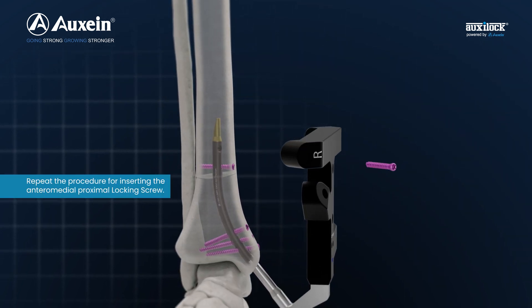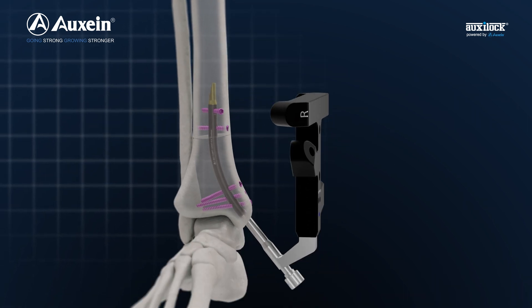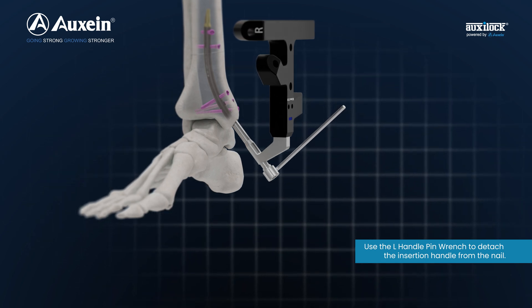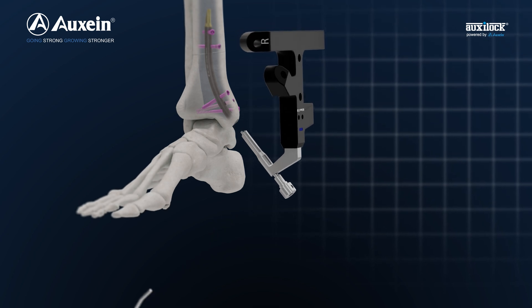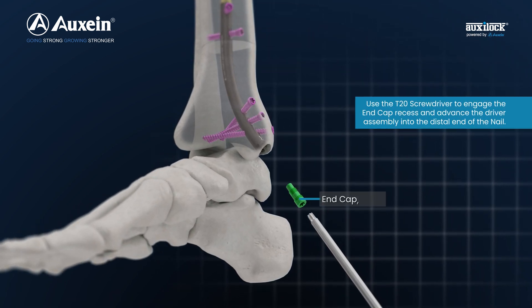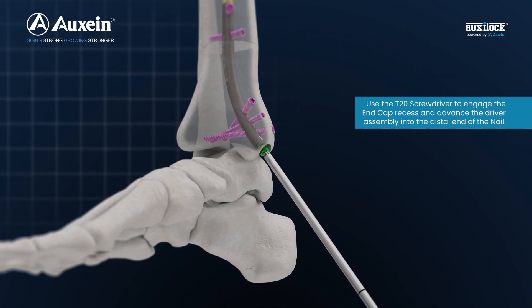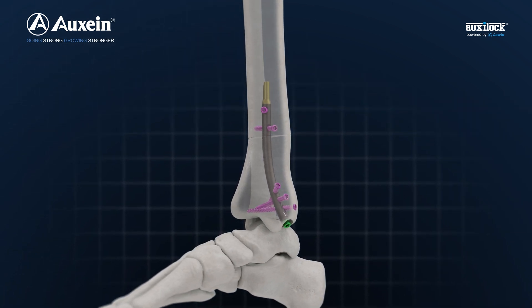Repeat the procedure for inserting the anteromedial proximal locking screw. Use the L-handle pin wrench to detach the insertion handle from the nail. Use the T20 screwdriver to engage the end cap recess and advance the driver assembly into the distal end of the nail to anchor.